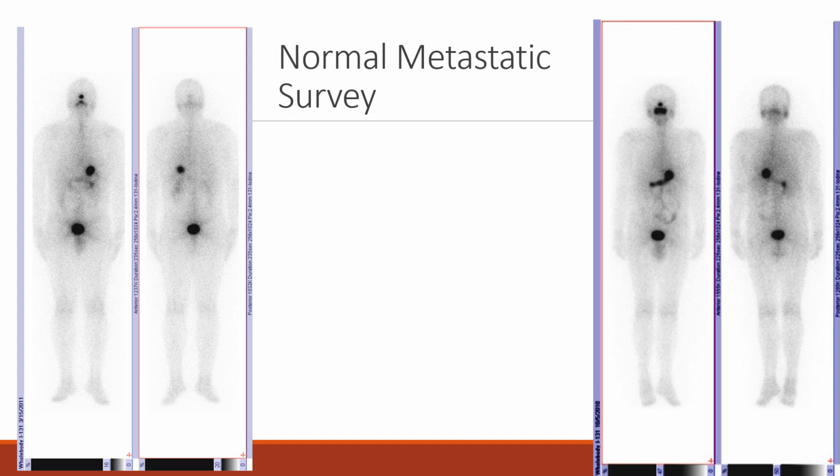All right, so these are a couple normal pictures. It's normal to see activity around the sinuses in the mouth. They swallowed a pill, so it's normal to see stomach activity. Everybody's stomach is slightly different shape and size. These are 2 different patients, but you see that the stomach is a little bit more J-shaped in the one on the right and a little bit more circular on the one on the left. Perfectly normal. They just have different shaped stomachs.